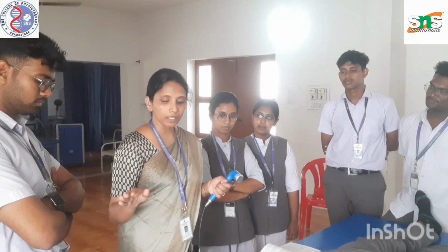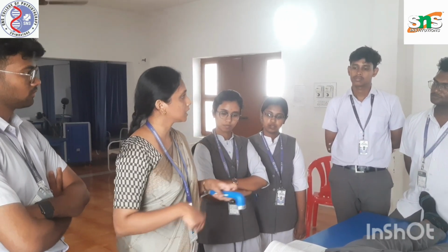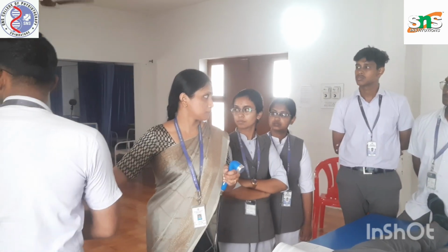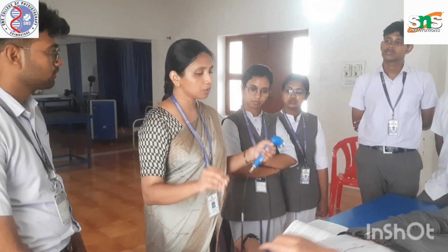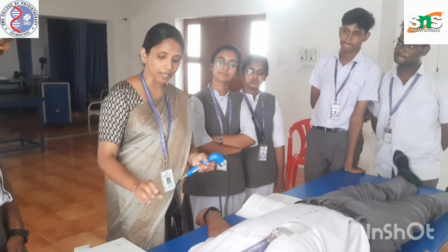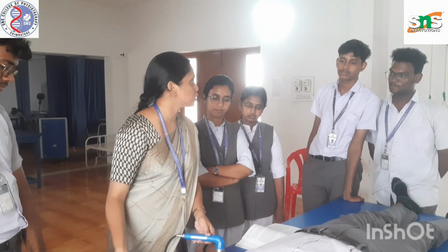Okay. So in the apparatus you have seen about the production theory. For that, first you should not switch on the machine. You have to place the patient, make the patient comfortable, and explain what you are going to do. Then you have to set the parameters, and only then can you switch on the machine.